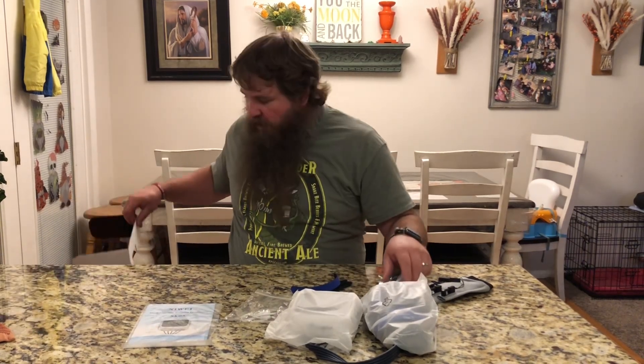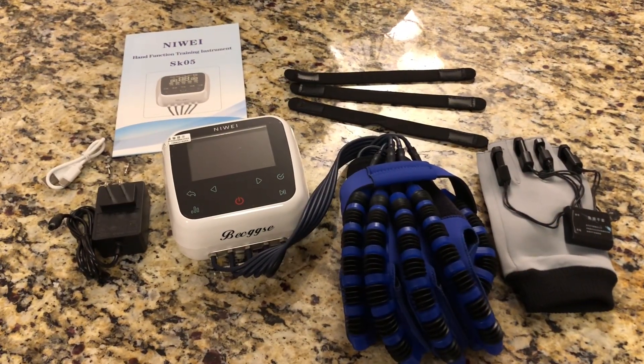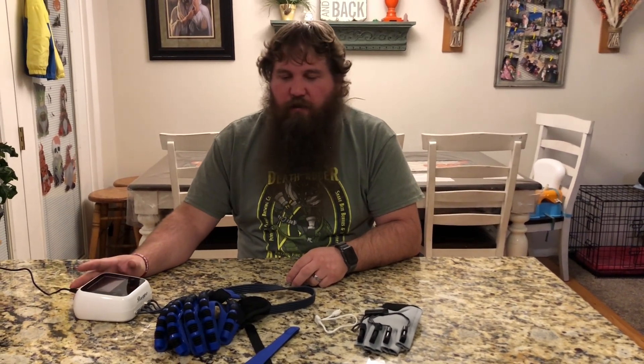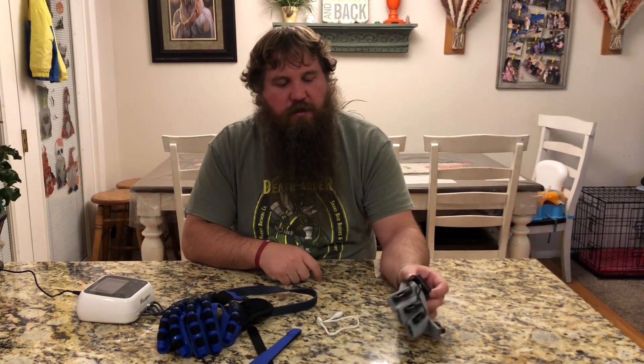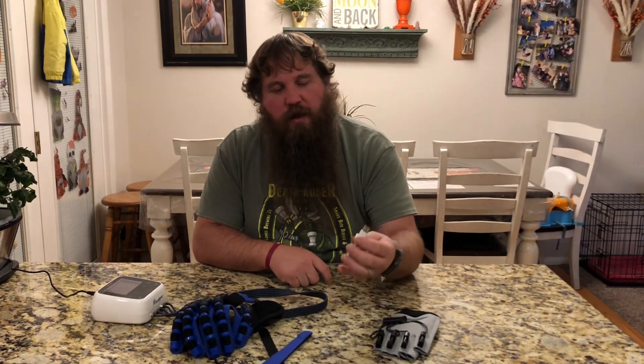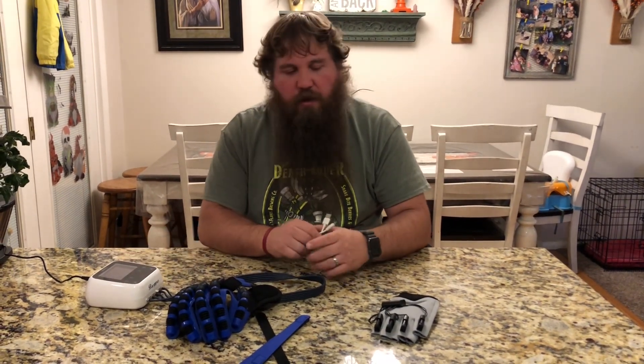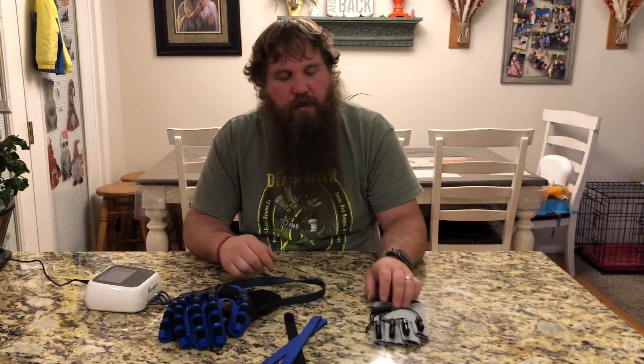We're gonna finish taking everything out of the wrapping and learn a little bit more about how this works. So I've got the main unit plugged in here. One thing to keep in mind is this sensing glove does have a separate battery with an included USB charger, so you're gonna have to charge this separately from the main unit.